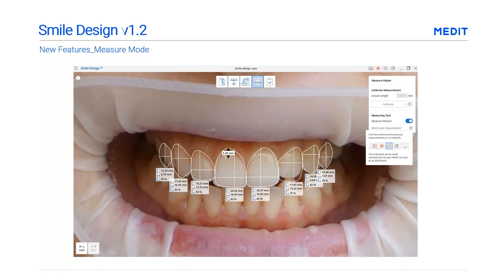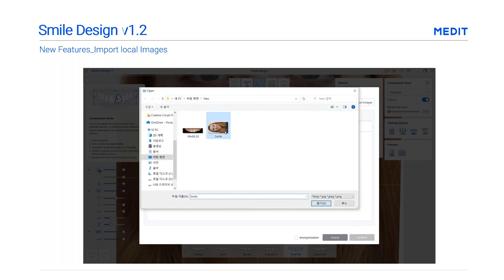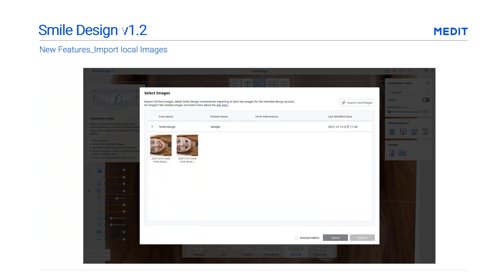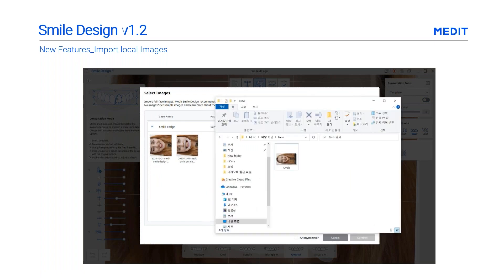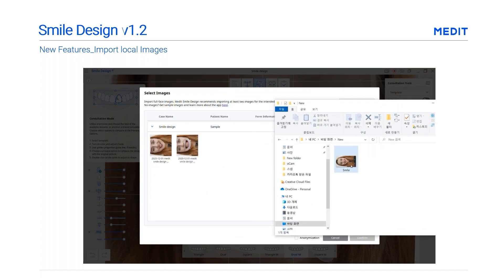An image importing feature has also been added. It is now possible to import local images without attaching them to Medit Link first. You can import local images by clicking Import Local Images in the right corner, or by dragging and dropping images in the import dialog window. They will be added automatically to the Medit Link case.